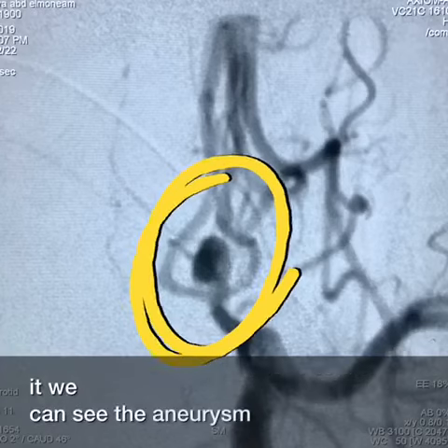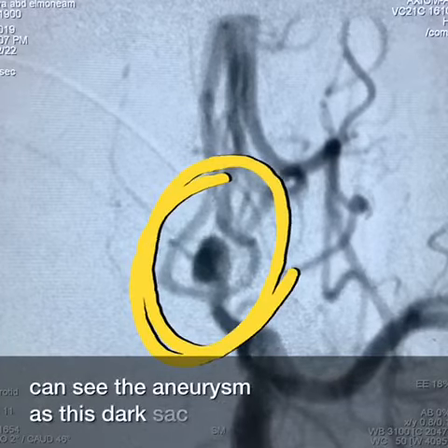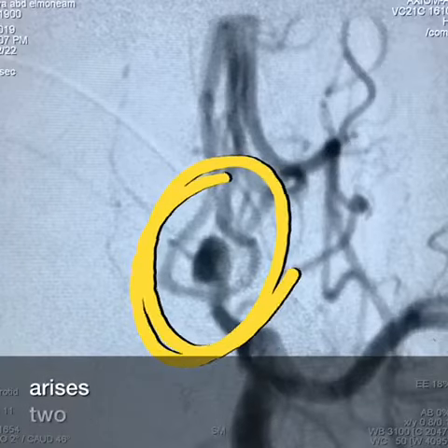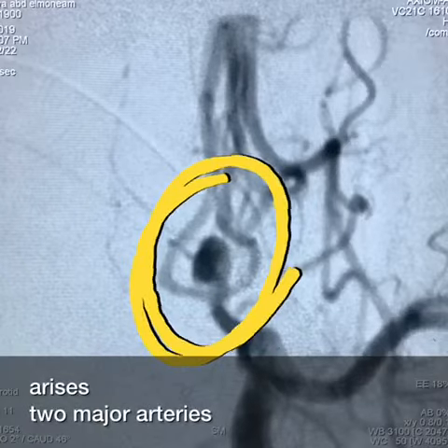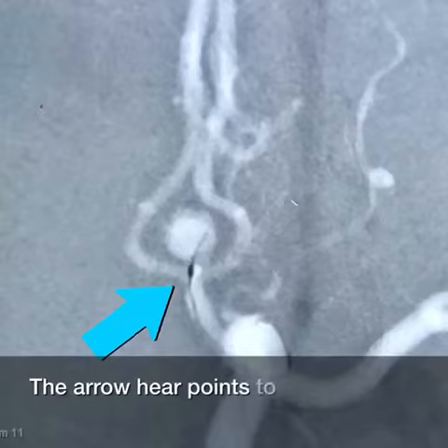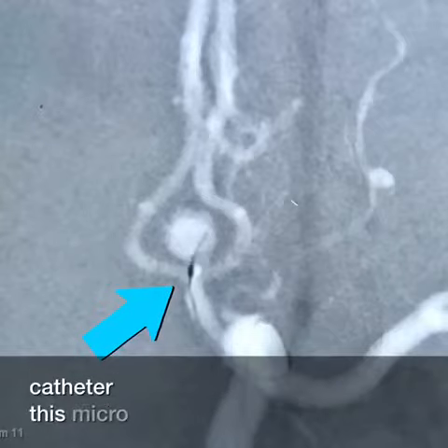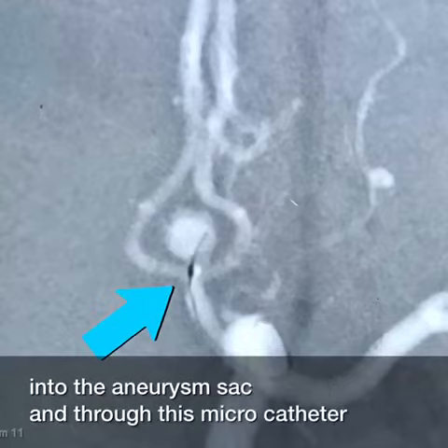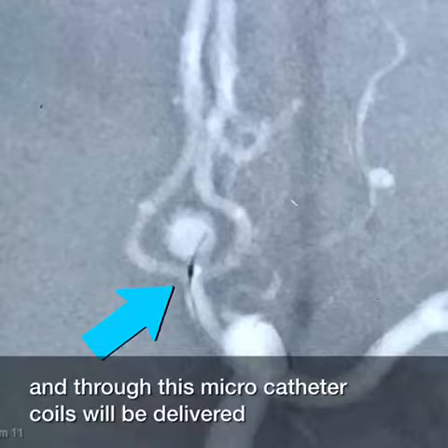We can see the aneurysm as this dark sac, and below this aneurysm arises two major arteries. The arrow here points to a microcatheter. This microcatheter is inserted into the aneurysm sac, and through this microcatheter, coils will be delivered.